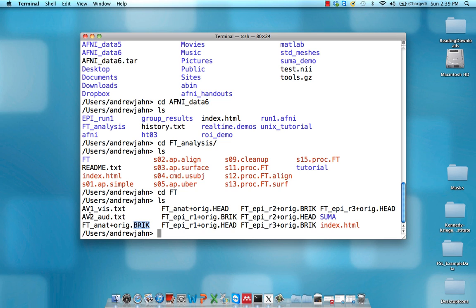We also have av1_vis.txt and av2_aud.txt. In this experiment, there was a visual and an auditory component, and it was a block design. They would expose the participant to 20 seconds of visual stimuli and then 20 seconds of auditory stimuli and switch between them. It's a block design because we have a long period of time with only one condition.